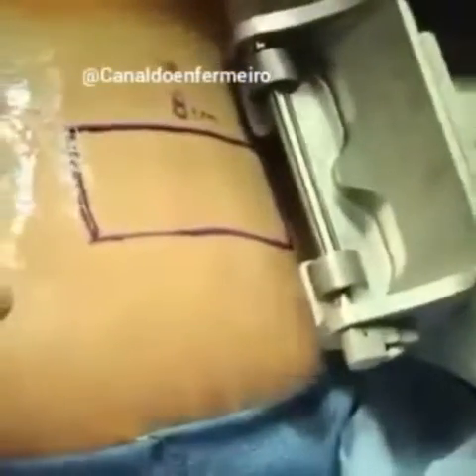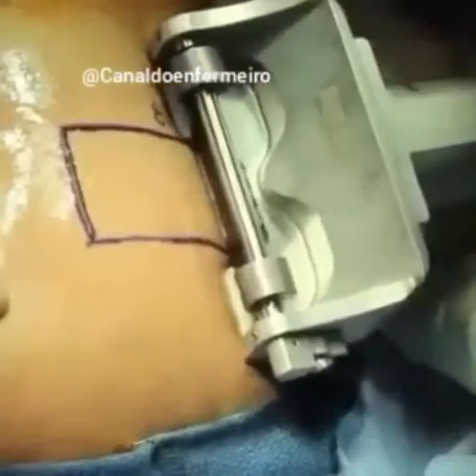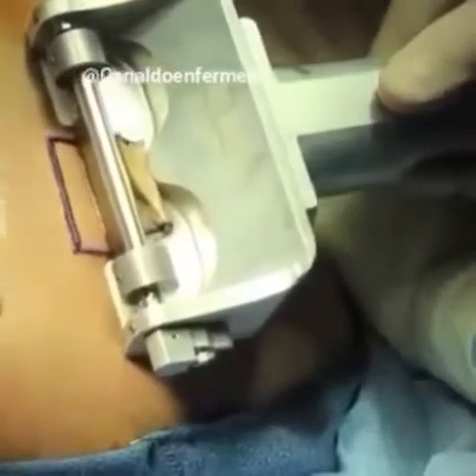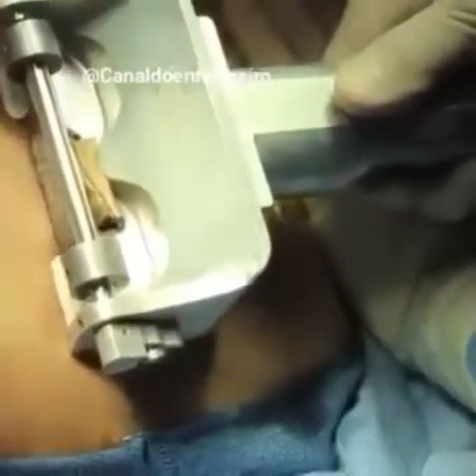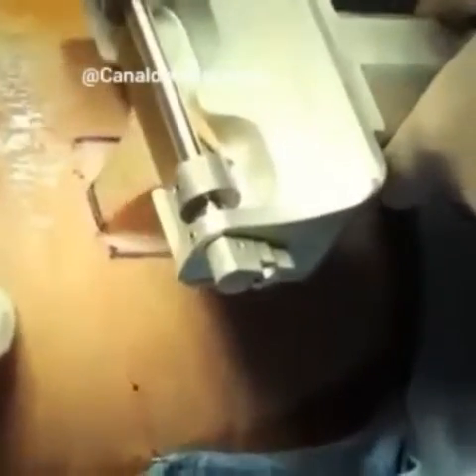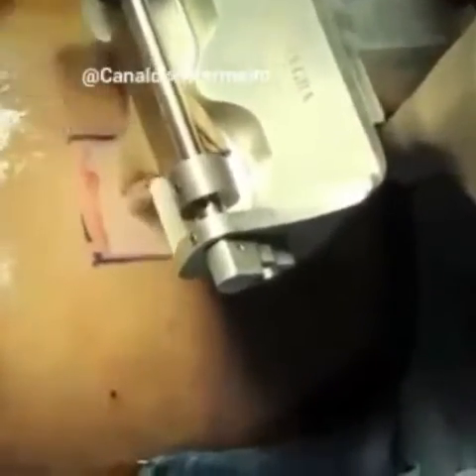The dermatome is turned on and then very slowly and carefully the skin graft is harvested. You can see the skin collecting here. Care is taken when we reach the end of the desired length of the skin graft, because it can remain stuck — it is simply trimmed off.